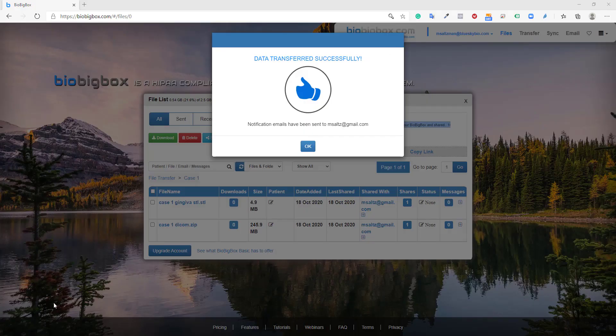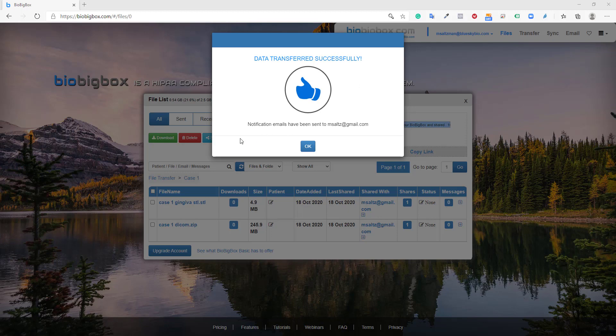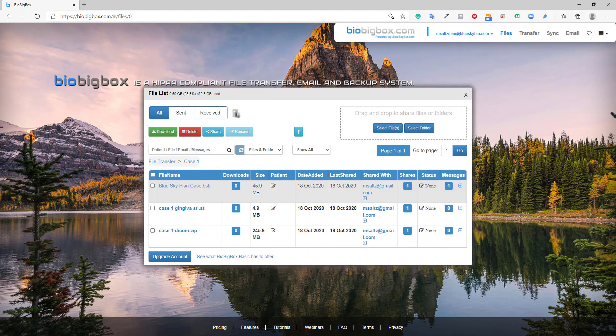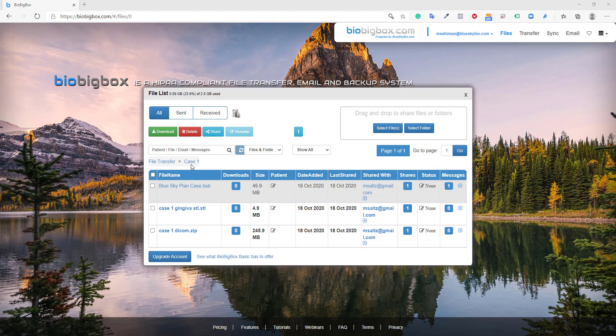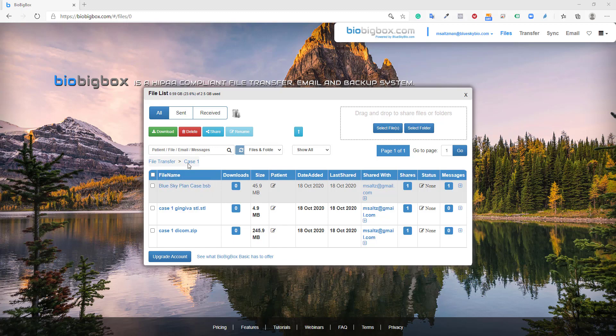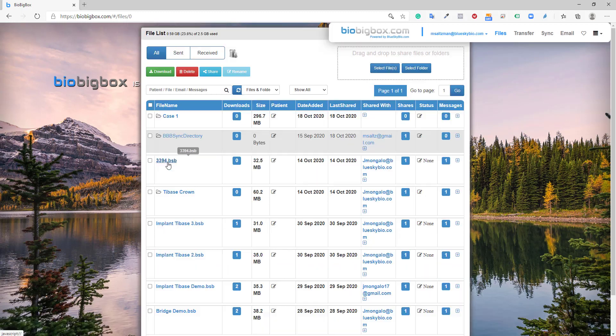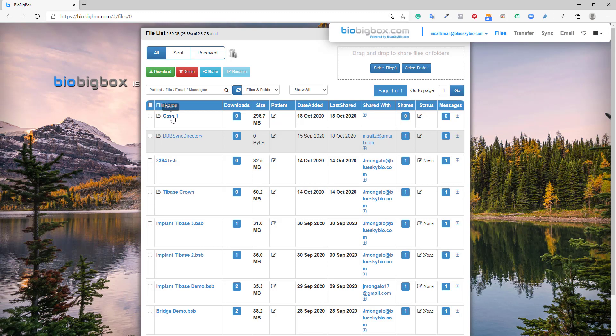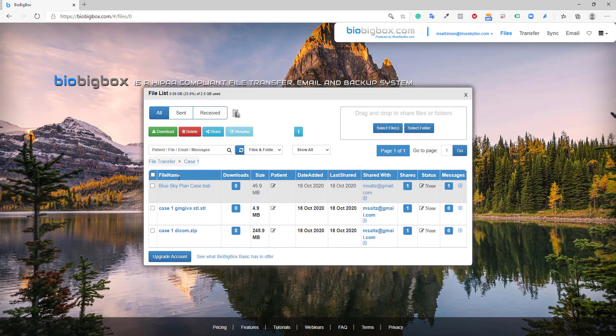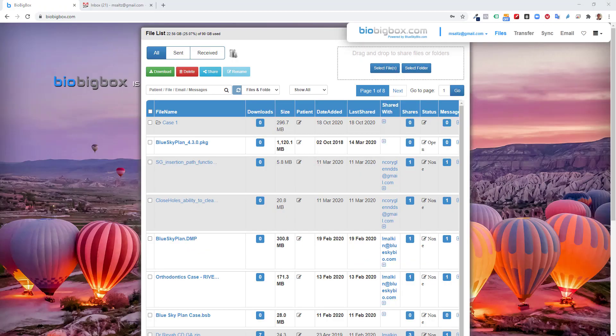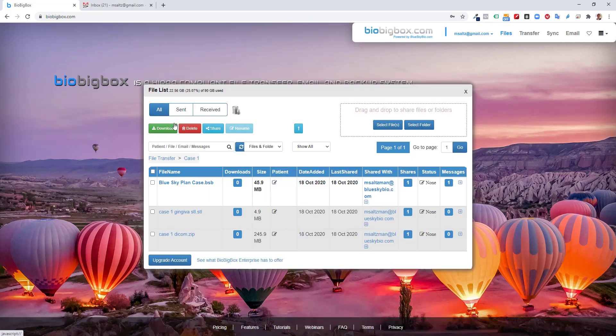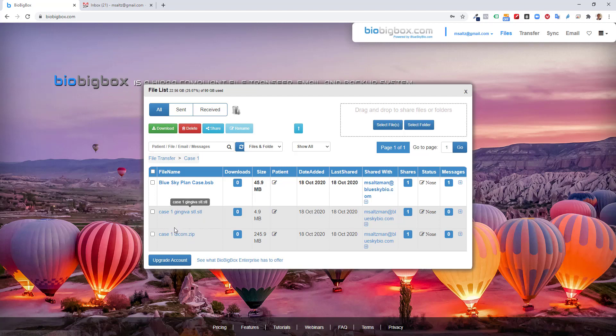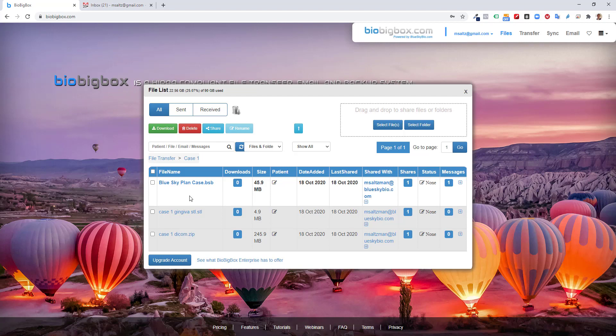So now the lab or dentist number two has now completed the treatment plan. And now we see in the lab or dentist number two's account that he has in his case one folder. He has the original files, DICOM files and STL file, and he has the completed treatment plan as well. Everything's organized within his file transfer list, within his file lists. We could see that case one folder now contains the relevant files. Now I jumped back to the original dentist who sent the case, and we could see the case one folder here as well. The case one folder contains the original files that the original dentist sent, and they're in gray as they're either files that he sent or files that he accessed already and read. So therefore they'd be in gray. The new file, just like a new email, is in white. It means that he hasn't yet accessed their download it. And we could see the new file, the blue sky plan case, that was uploaded by the lab or dentist number two.